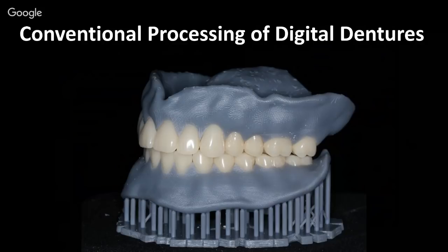One thing I'll mention about printed base material: when we do an acrylic base, the traditional workflow, you're going to have the little fiberglass particles in there. PMMA is very shatter resistant. One of the things with the printed resin, while it's got great compressive strength, it is more brittle. And so if you've got some little thin piece hanging out there that's not got much thickness to it, I think you're going to be very prone to that shattering and breaking.